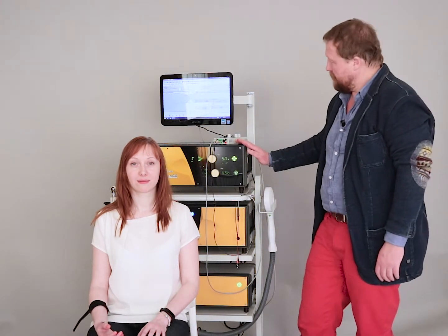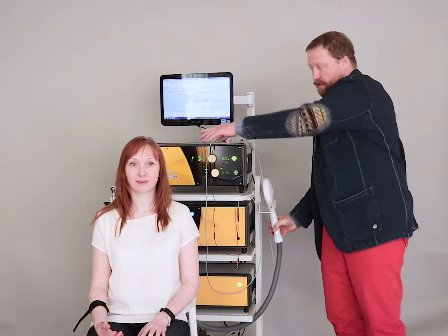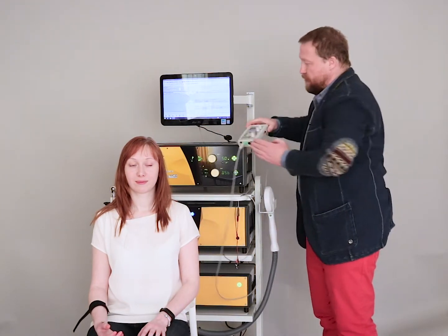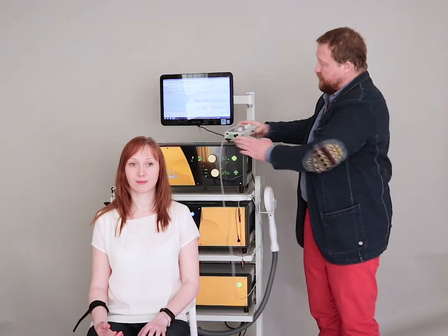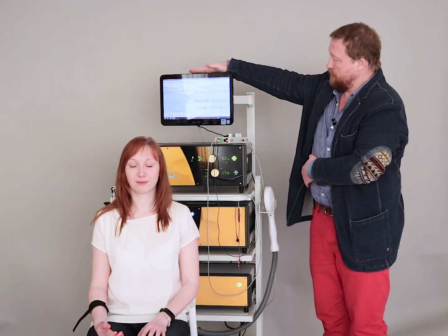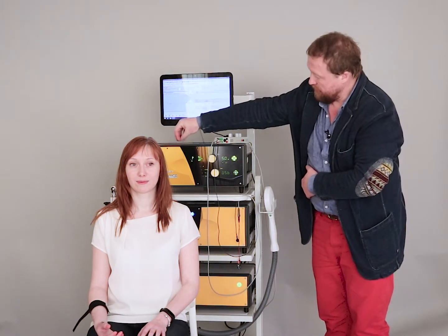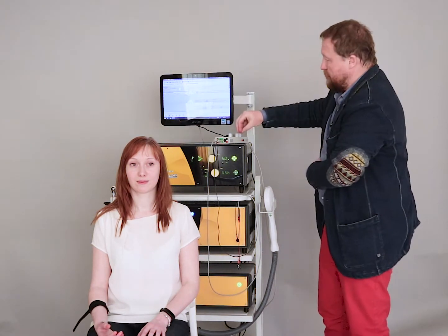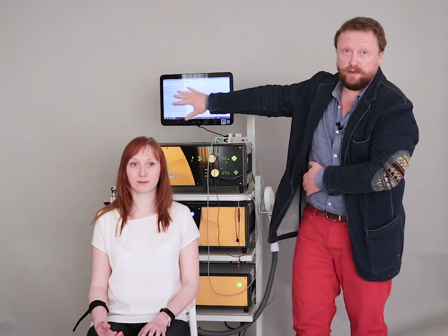This is a TMS machine. This is a TMS coil connected to the machine, and this is an EMG amplifier which is connected to this PC. TMS is also connected to this PC. On the PC I have the software which can talk to the TMS and to the EMG, and when I deliver the stimulus, the EMG machine can pick the signal and show it on the screen.